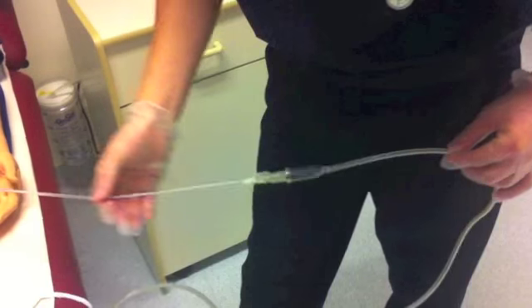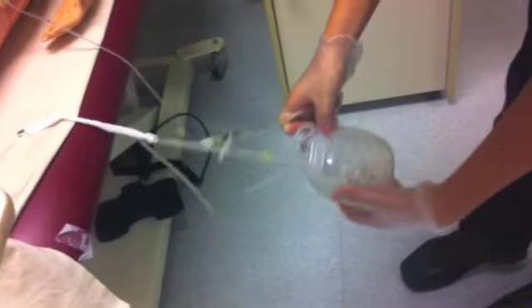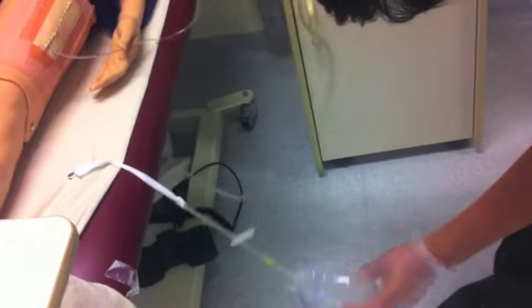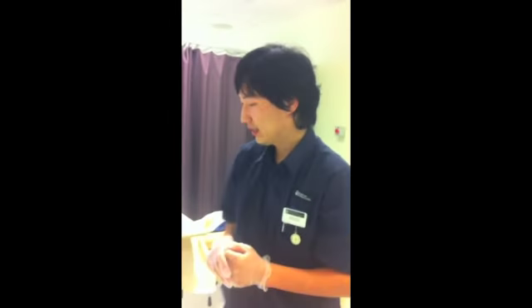We should also ensure, by observing the drain site and all along the actual drain, that no clot has formed, as this could prevent the drainage from flowing through the tube and cause a buildup of drainage. Now I'm going to show how to care for the drain and drain site.